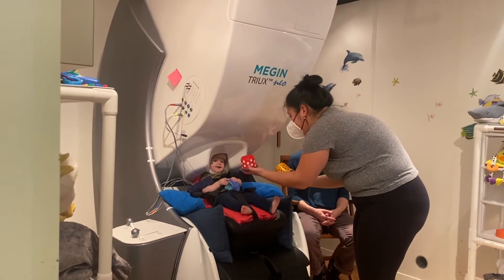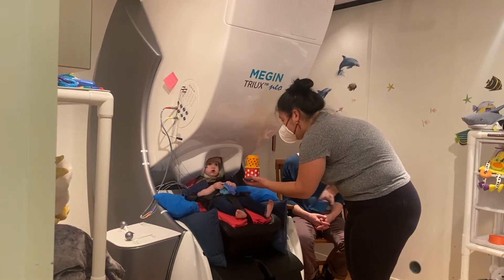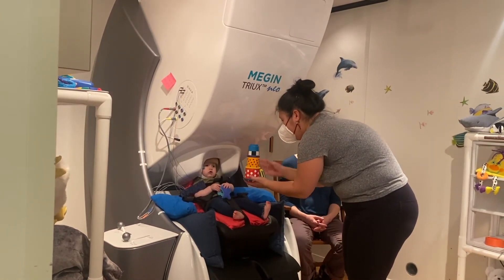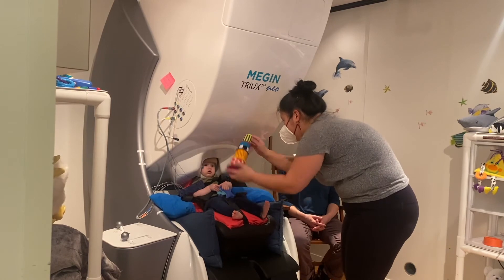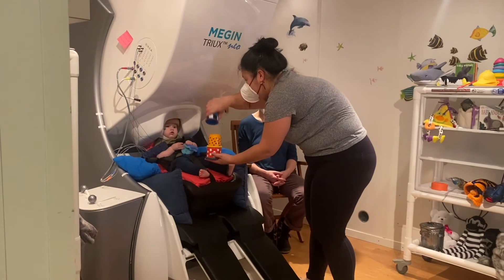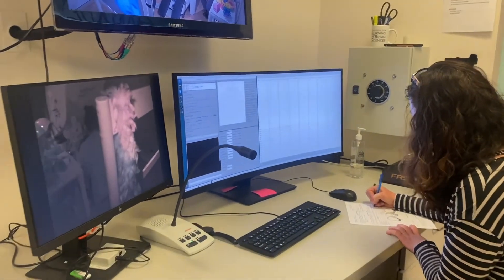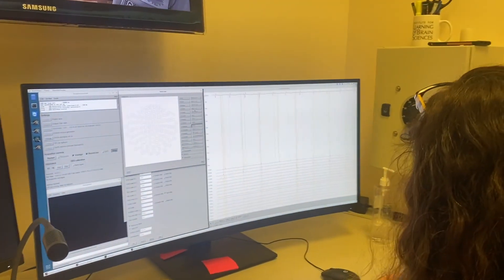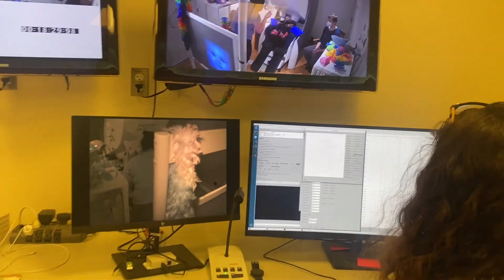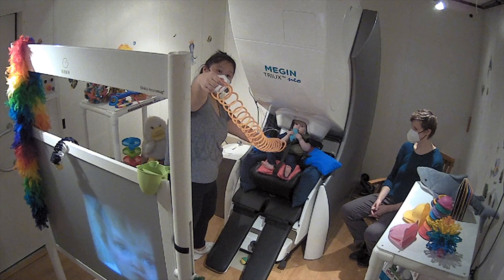You can see that the infant is able to move freely within the helmet during the MEG session. Our software allows us to easily compensate for the infant's movement during the pre-processing stage of data analysis using movement compensation algorithms. Outside the MSR, the technician constantly monitors the sensors, the infant's behavior, the baby's head position in the helmet, and takes detailed notes on the testing session. As is the case for all data collection procedures involving young infants, practice makes perfect.